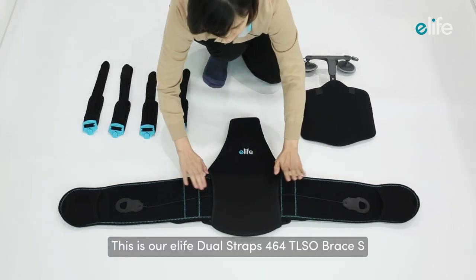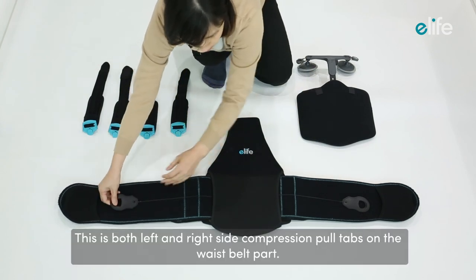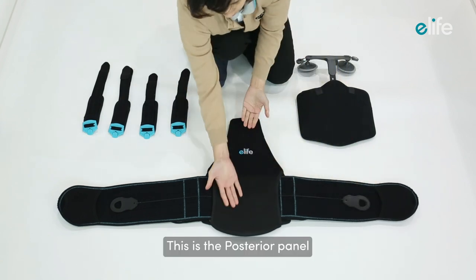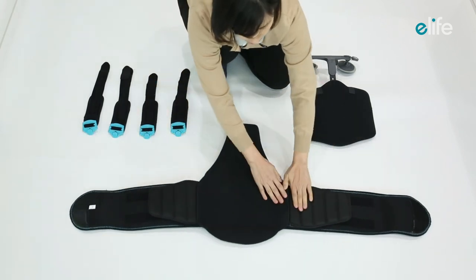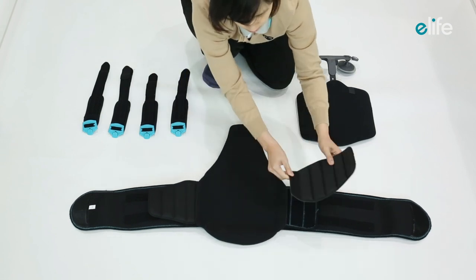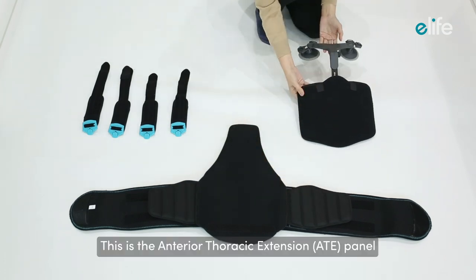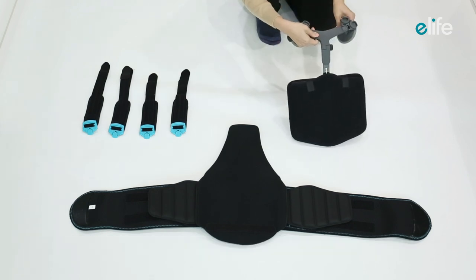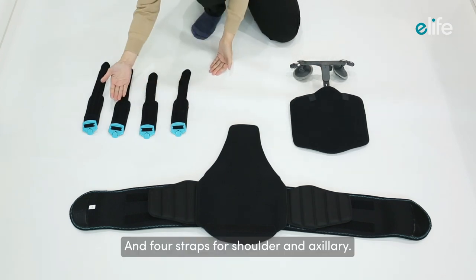This is the E-Life Dual Straps 464T LSO brace. It features both left and right side compression pull tabs on the waist belt, a posterior panel, and two side protection soft pads on the inside. It also includes an anterior thoracic extension panel, two independently spherical rotatable chest pads above, and four straps for shoulder and axillary support.